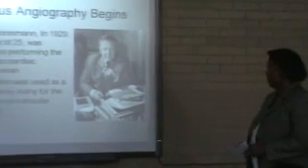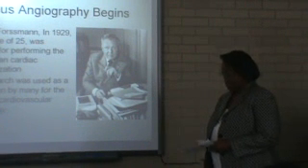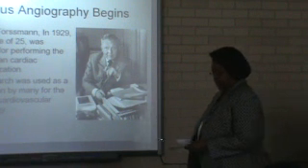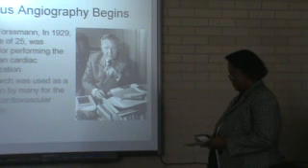In 1929, Werner Forssmann first introduced the venous angiogram in the body. He injected himself with contrast medium, and then he went up and took x-rays. His research was the foundation for many studies of cardiovascular disease. His methods were done directly to the locations as needed.